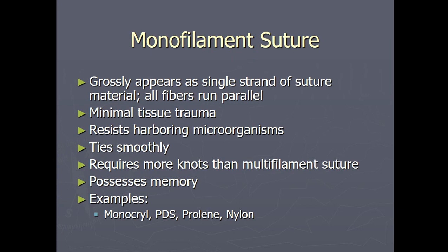Examples of monofilament, synthetic and non-synthetic: absorbable synthetic like Monocryl and PDS. Non-absorbable synthetic, for example Prolene, nylon.